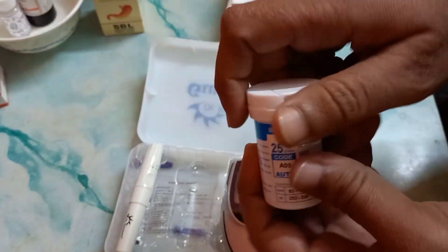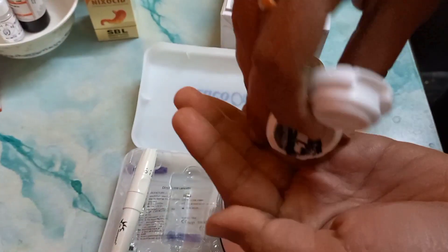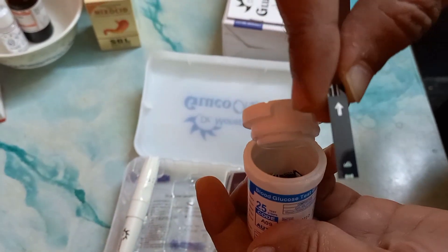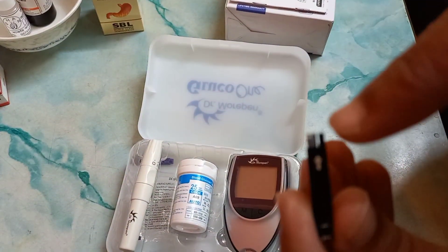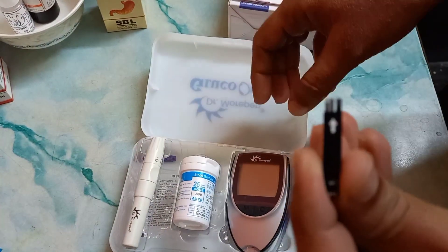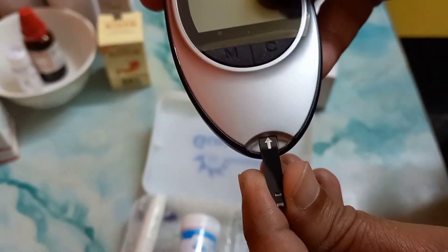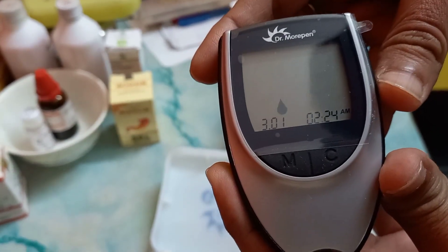Now let's check how to use the monitoring strips. First of all, take a strip. There is an arrow sign on the strip — insert the strip into the monitor along the direction of the arrow. It's very easy. The monitor is ready.